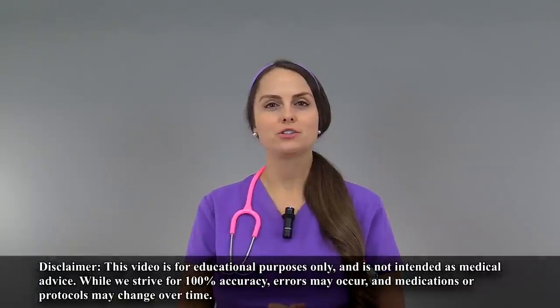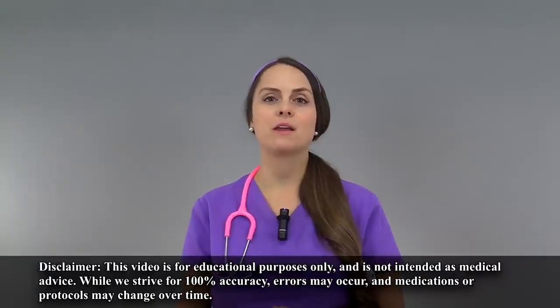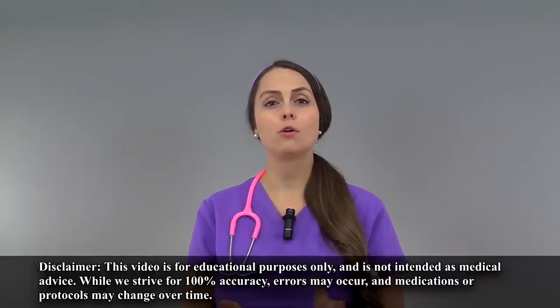In this video I'm going to demonstrate how to withdraw medication from a vial. When withdrawing a medication from a vial, you want to make sure that you're following your employer's latest guidelines and the drug manufacturer's recommendations for withdrawing that medication from a vial.